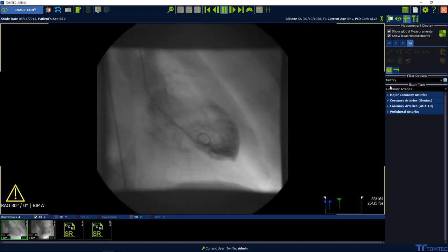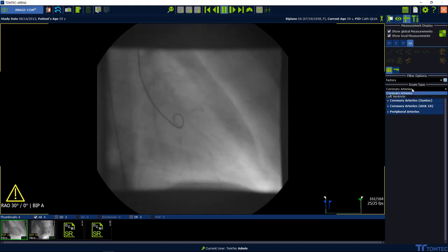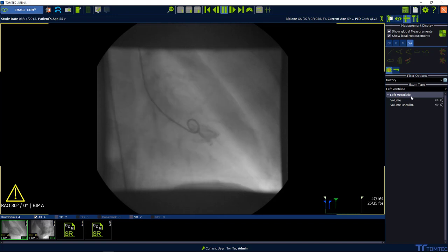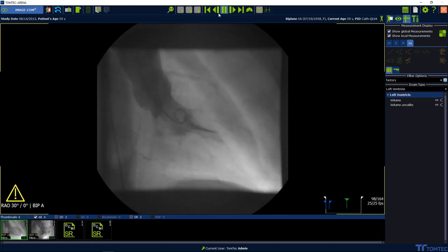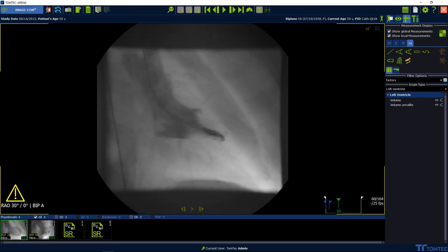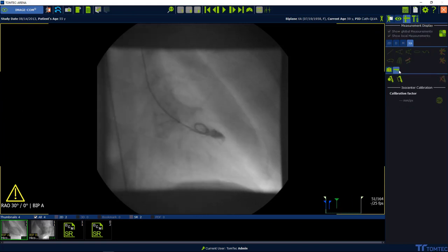Select the measurement package in the upper right-hand corner and go to the left ventricle measurement package in the drop-down. Before you jump to the measurement package, please go one step back and select the calibration tab.